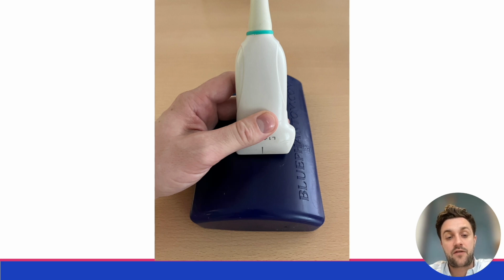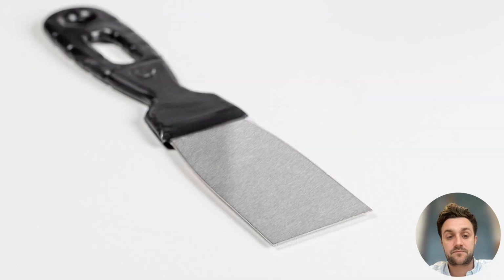If you have your thumb facing towards you, holding it down near the shoulders of the probe, which are here, and then our fingers at the back with part of the hand resting onto the patient's skin or something, so that we get the extra tactile feel so that we're not slipping around.